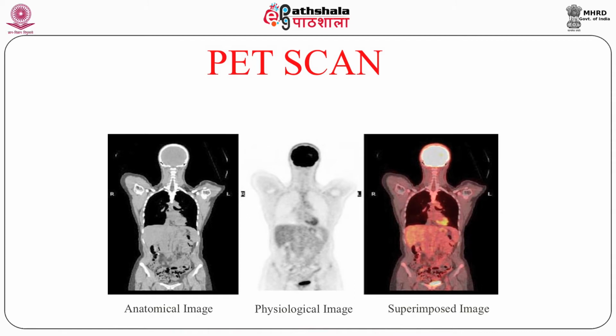It has come from the unit which is attached with the PET. The physiological image you are getting from the PET. Now, what exactly happened? The quality of the image, if you see from the CT part or MRI part, is very good. You can resolve it, you see the resolution, but the same quality or clarity of the image is not there when you take the scan from the PET.